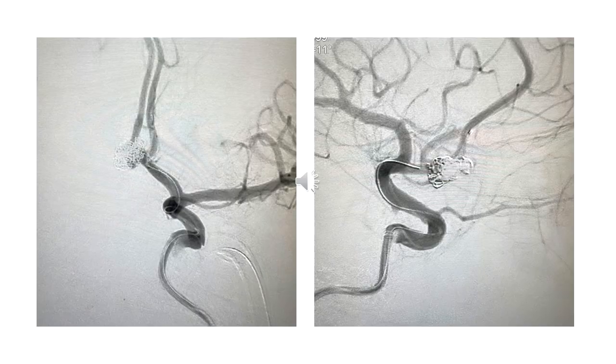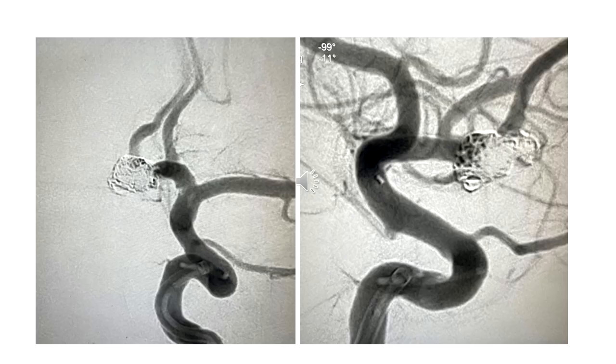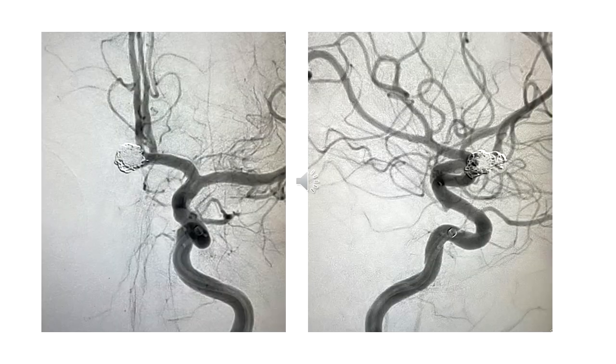To deploy coil safely inside the aneurysm, here we can see good progress. However, there seems to be some small clot formation at this point. Not resolved, and we can see the arteries are well patent now. We can see the aneurysm is occluded. There are some loose coils at the base. However, there is adequate occlusion of the lobule as well as the dome and the fundus. We can see that there is reasonable coiling.